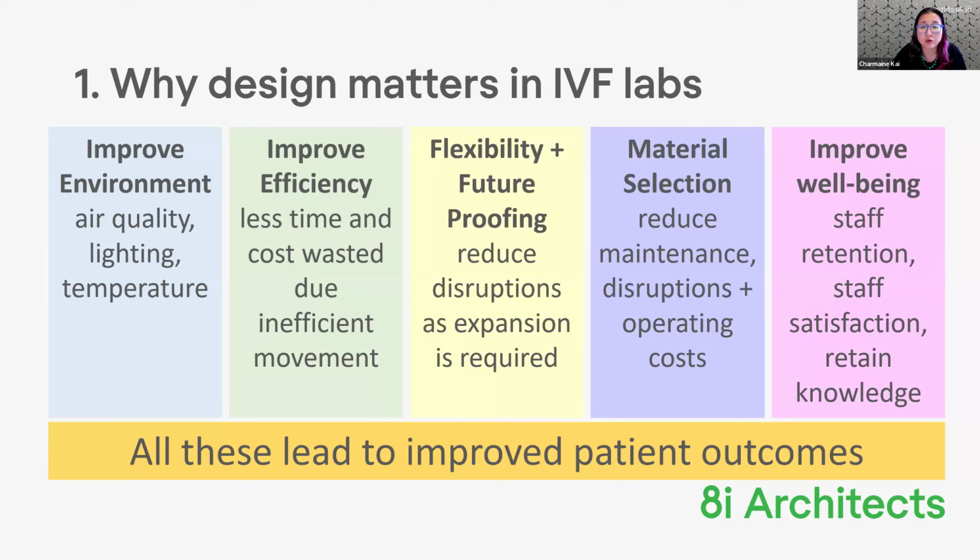So it's really important that you allow for enough power, gases, and space within the lab to grow without significant disruption, because to construct within a lab basically renders that lab inoperable. The amount of dust and dirt that's created during the construction process means you just can't have a lab running. So to be able to make plans for growth that minimise any disruption within the lab will save you a lot of time and money in the future.